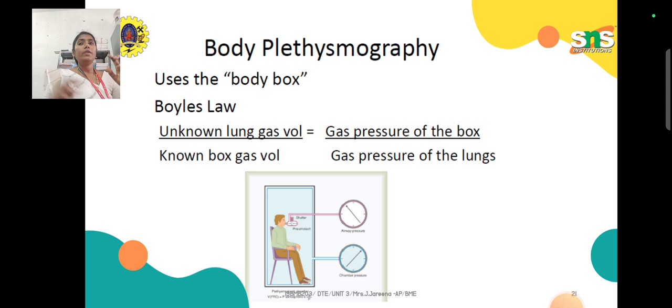Okay, so we have to understand one concept, that pressure and volume are inversely proportional. You already might know that whenever the volume is increasing, the pressure will decrease. Consider a very big classroom. It's very spacious, in the sense the pressure is very low.